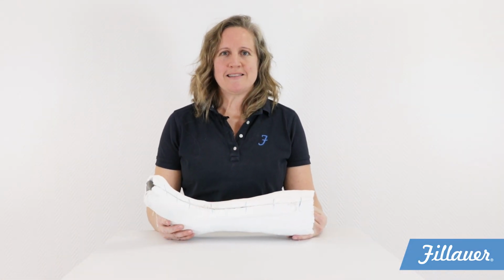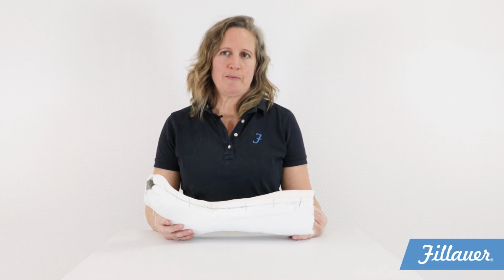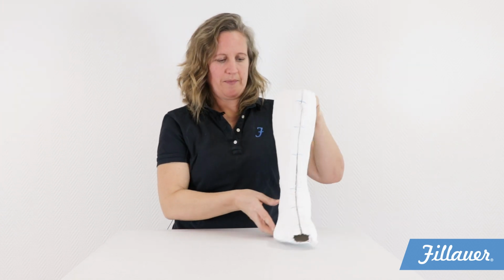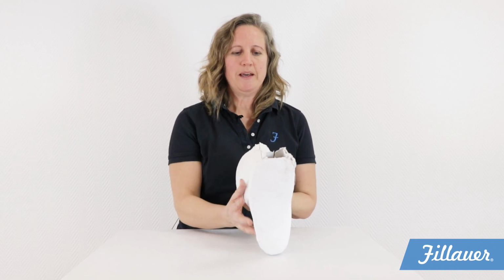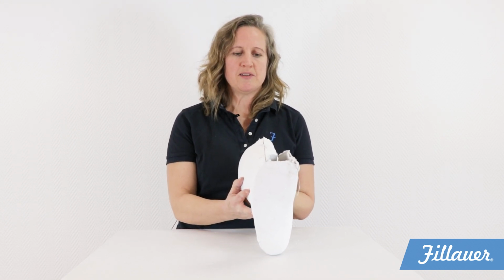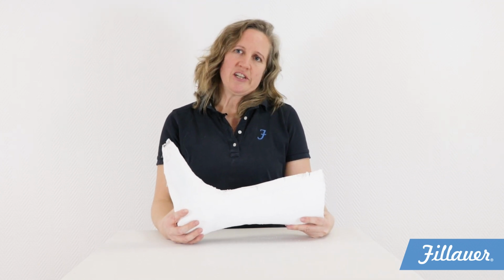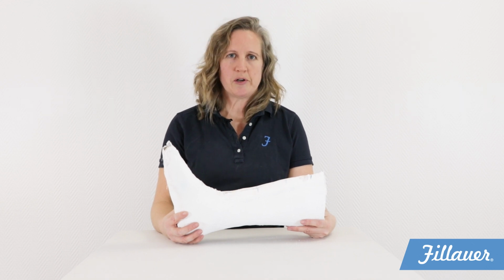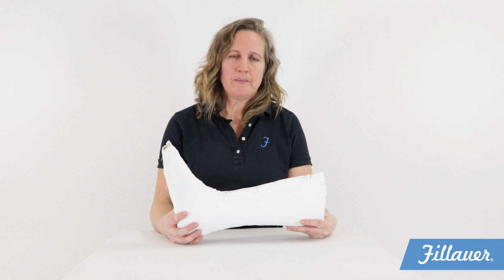When you're finished casting, make sure the cast is in neutral position in all 3 planes. You look in the sagittal plane, the frontal plane, and the transverse plane. Here you look so the foot is not rotated. This is important as we can't change the cast. If we do get a cast which is too far off neutral, we can't build a brace on it and the order will be rejected.